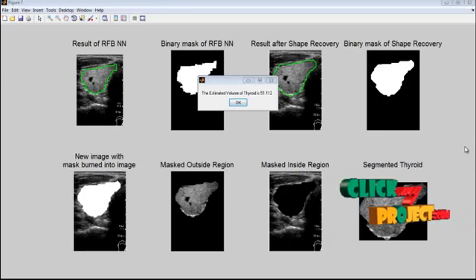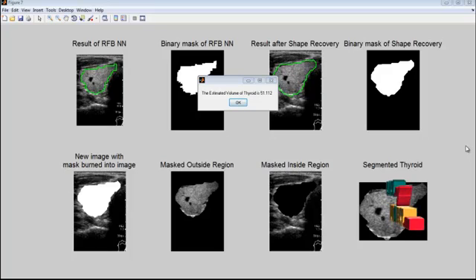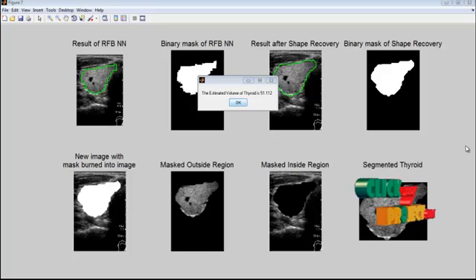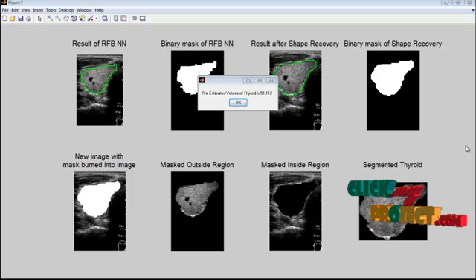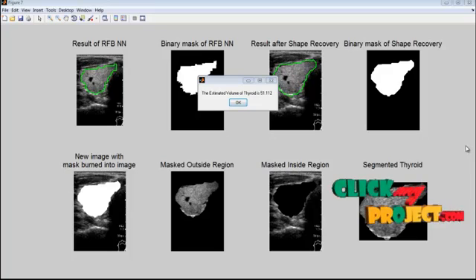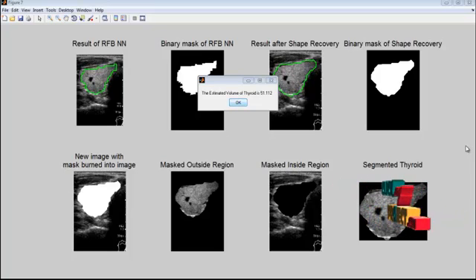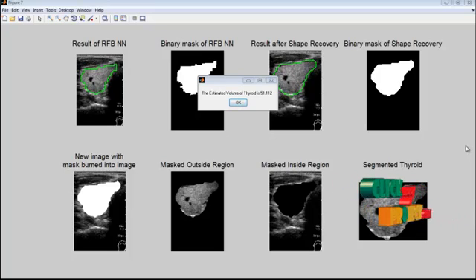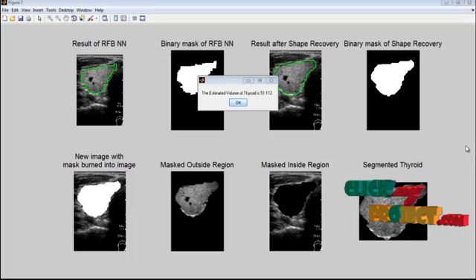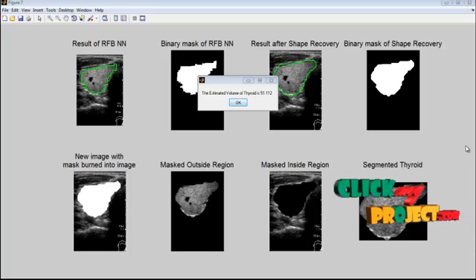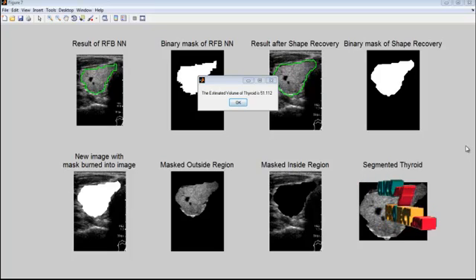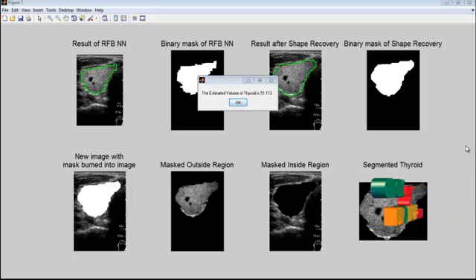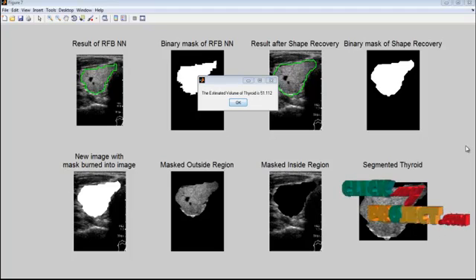From this demo, we can conclude that a convenient system for thyroid segmentation and volume estimation has been proposed. It includes image enhancement processing to remove speckle noise, which greatly affects segmentation results from ultrasound images. The RBF neural network classifies regions into thyroid and non-thyroid glands, and a region growing method recovers an accurate shape of the thyroid gland.